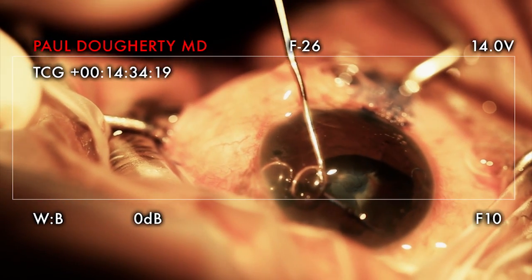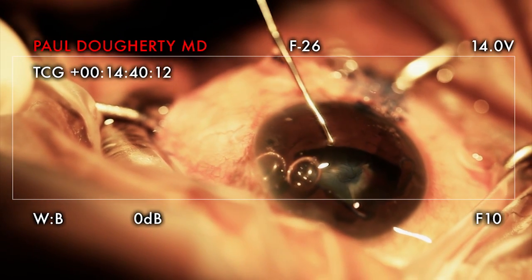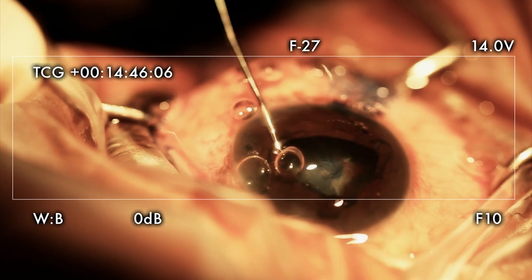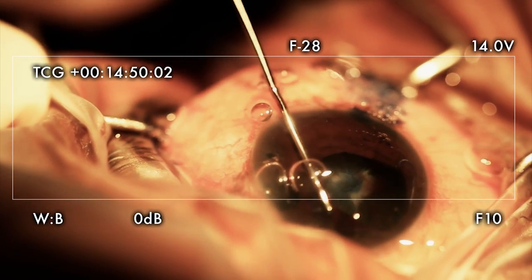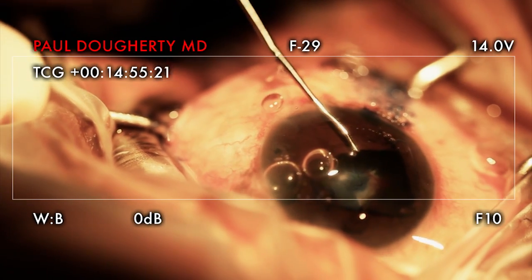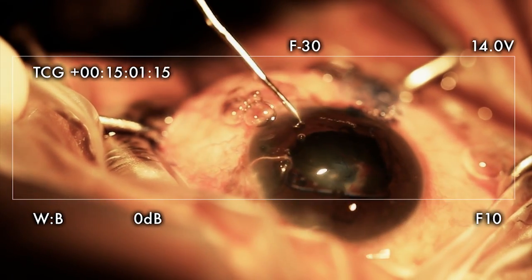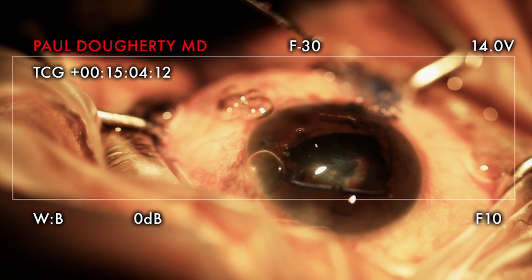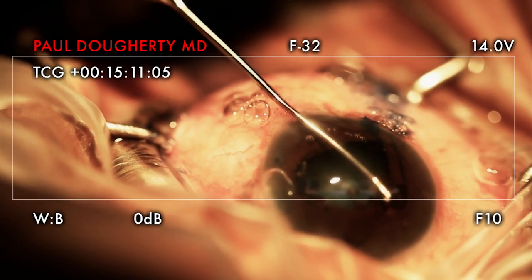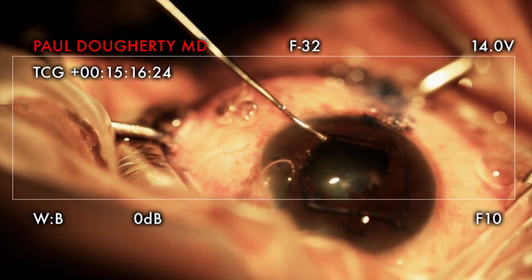The patient's head is moving. We've got to make sure everyone's taped. The head's moving — I think we're going to have to probably remove it. She's really moaning in pain here.